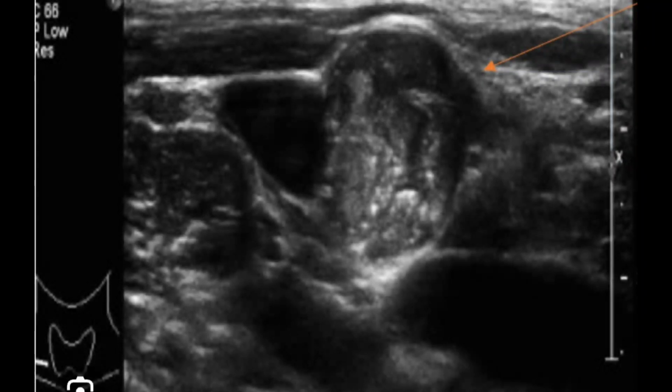There are certain levels of the neck lymph nodes, the cervical lymph nodes. Therefore always be specific when you are explaining. On top of it, if you could mention whether the lymph nodes are smooth or hypoechoic, with irregular margin, or with or without vascularity, this would be absolutely fantastic with respect to explaining thyroid nodules.